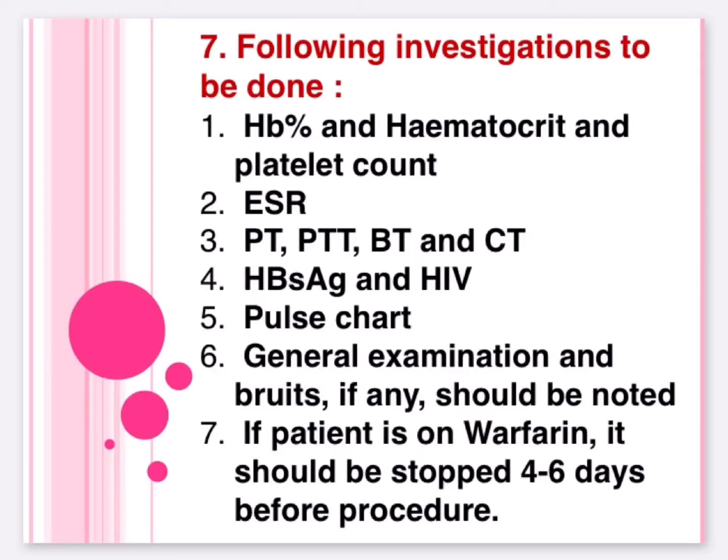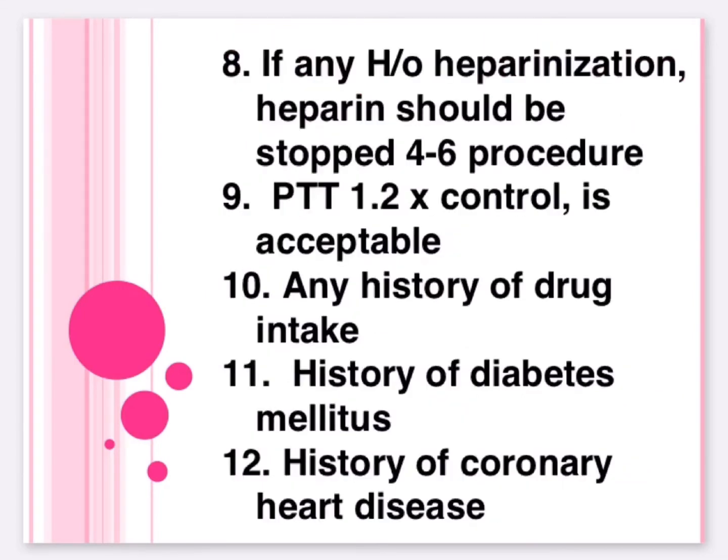7. If the patient is on warfarin, it should be stopped 4 to 6 days before the procedure. 8. If any history of heparinization, heparin should be stopped 4 to 6 hours before the procedure. 9. PTT of 1.2 times control is acceptable. 10. Any history of drug intake. 11. History of diabetes mellitus. 12. History of coronary heart disease.